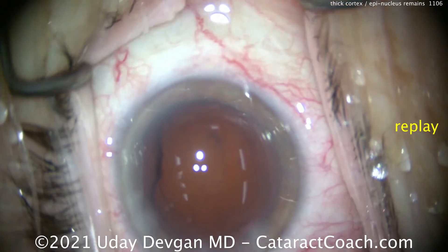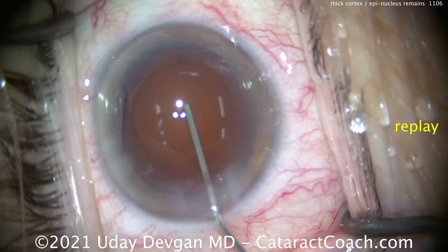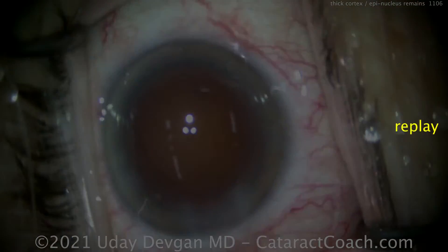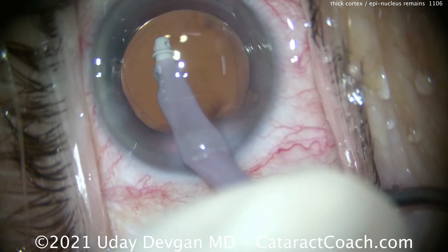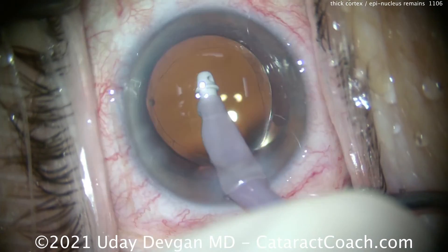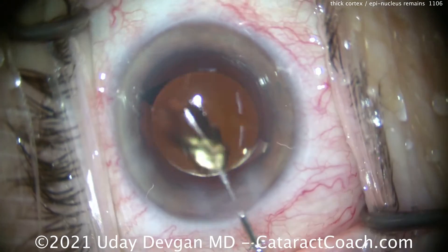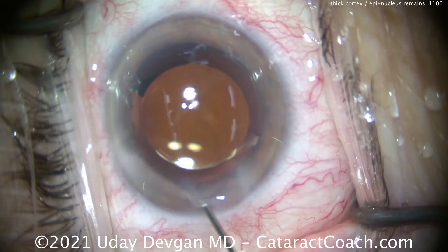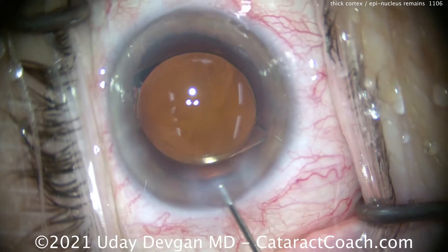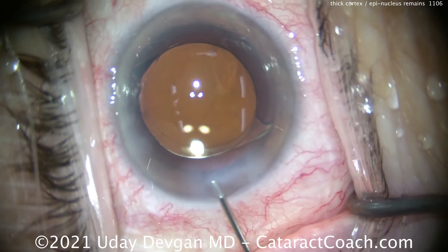So if you get a case like this, the issue was an insufficient degree of initial hydrodissection. Your hydrodissection wasn't as good as you thought it was. We learn from this material — if I do a little bit better hydrodissection next time, I won't have to spend as much time doing that epinuclear shell removal with the IA probe.